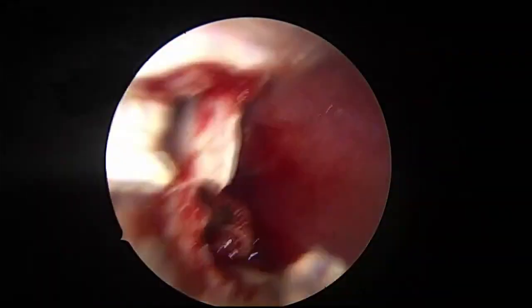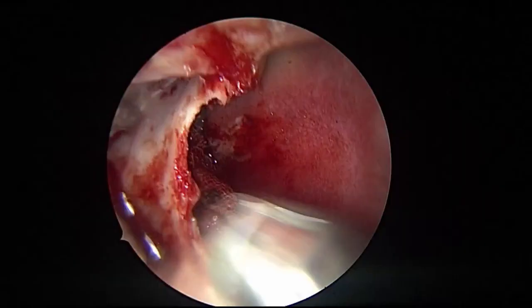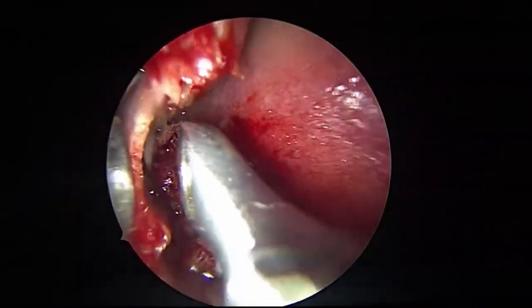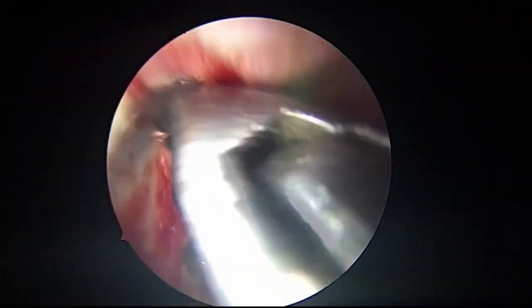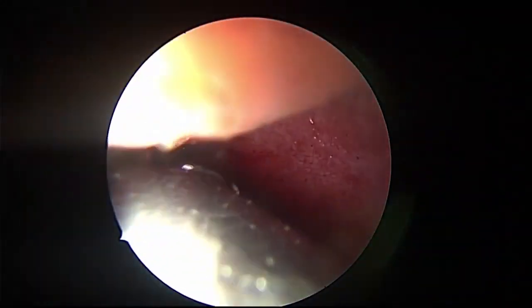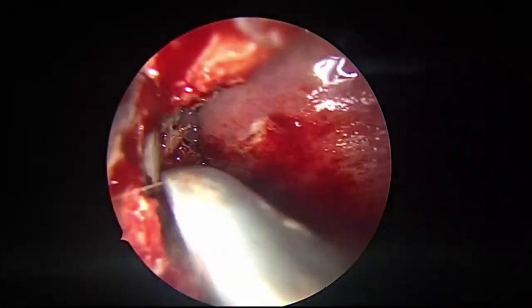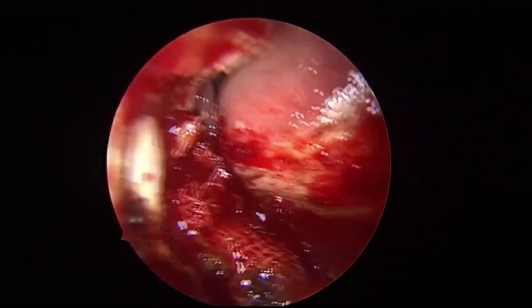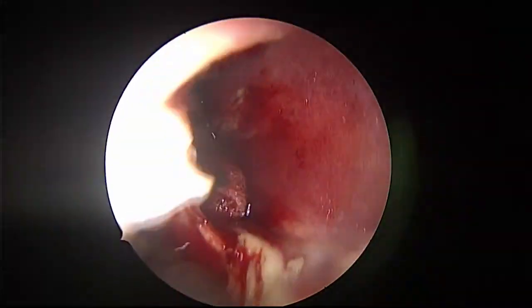This bone, once we remove, will take you inside the maxillary sinus head on. Okay? Thin bone can be punched with a Luc. See what is there behind this, the nasolacrimal duct.